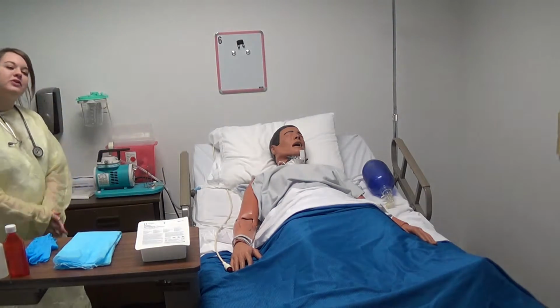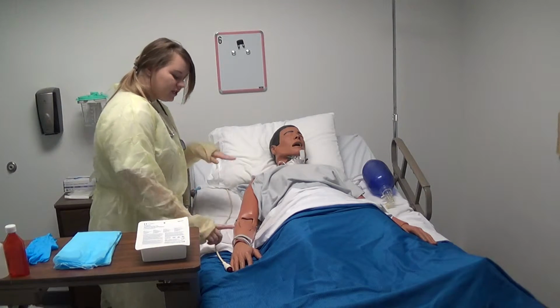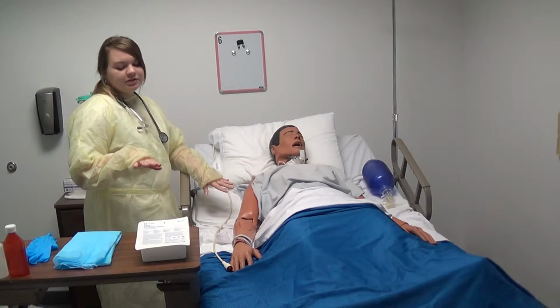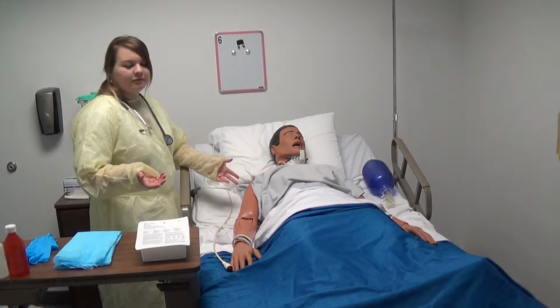I'm going to enter the room, wash my hands, and introduce myself to the patient. I do want to check my patient identifiers and have him confirm with me his name and date of birth. I'm going to explain the procedure, which he probably already knows if he's had a trach before.